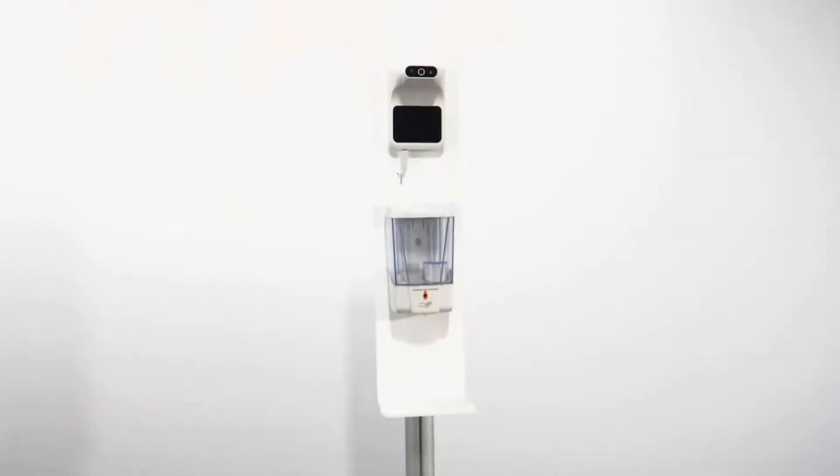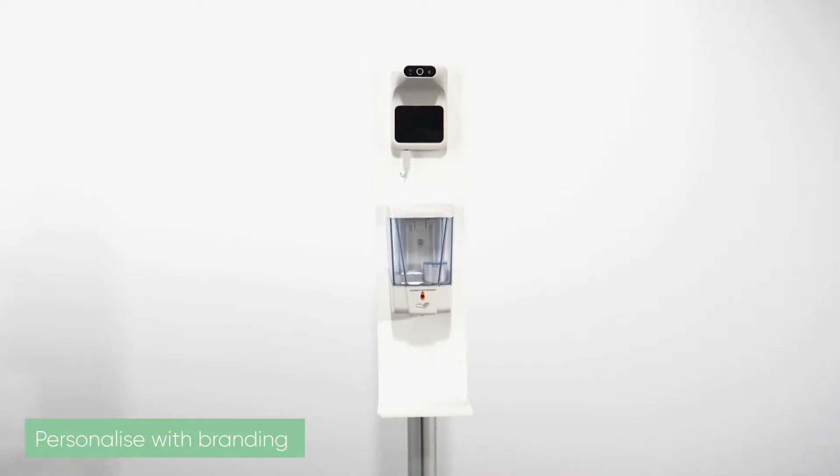Hi, my name is George and today we're going to be walking through the automatic thermometer stand. This is a great all-round product that incorporates an automatic thermometer with an automatic sanitizer dispenser.